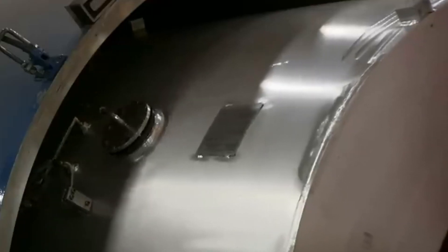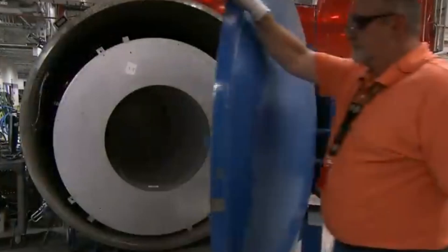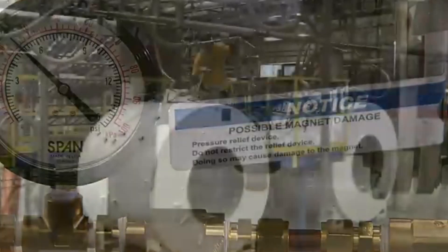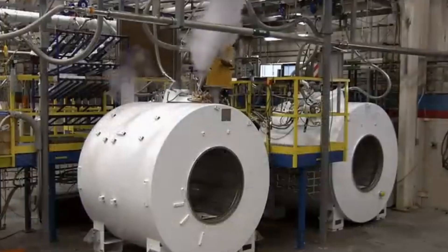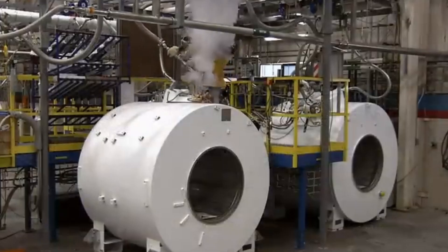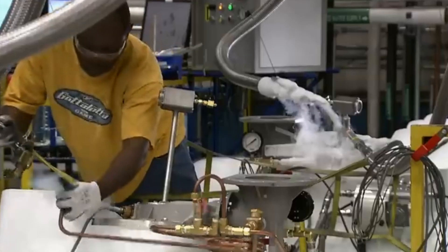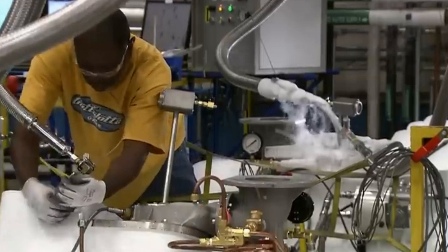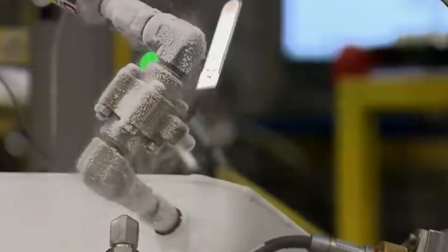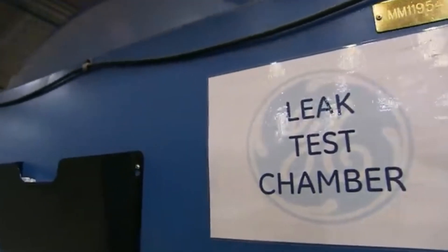They pump helium gas into the tube and activate a vacuum system that sucks out the air in the chamber. They then pump liquid helium into the magnet — it's one of the coldest things on the planet, and the fill nozzles turn frosty. Exposed to this extreme cold, the magnet loses all electrical resistance and becomes a superconductor, generating intense magnetic fields. A sensor confirms there are no leaks and the welds are tight.